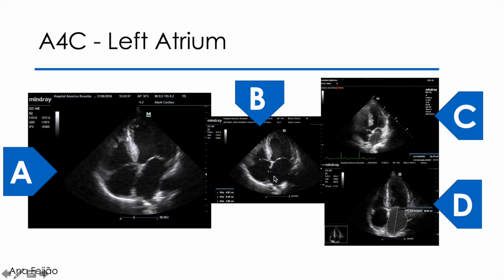Don't forget to evaluate the index volume, that is the volume calculated by mapping divided by the patient's body surface. So, and this protocol is the same for measurements of the right atrium, okay? Don't forget it.